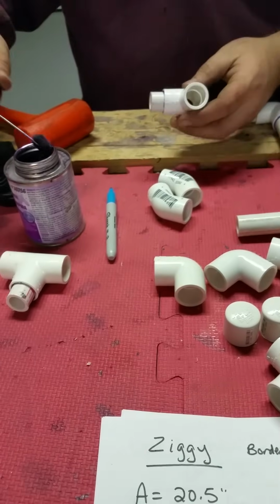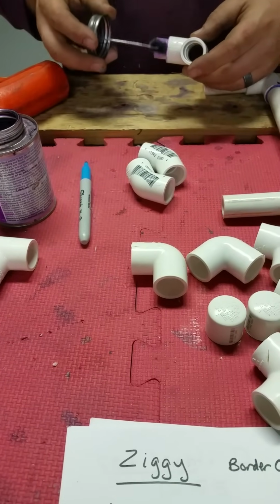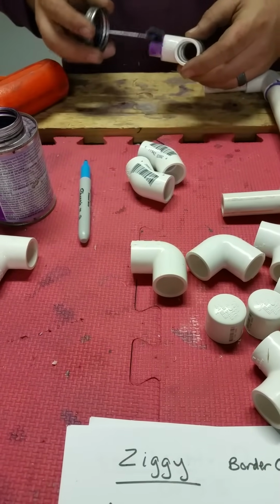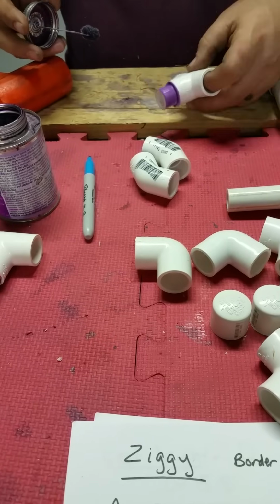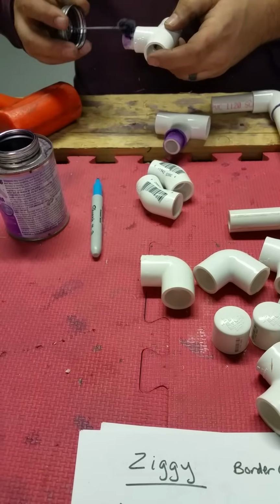Now we need to prime the other end. You don't want to prime it before you pound it in on the other end, because then you'll be holding on to the side that's supposed to be clean and prepared. So after you get one side in, then you can prime the other side.